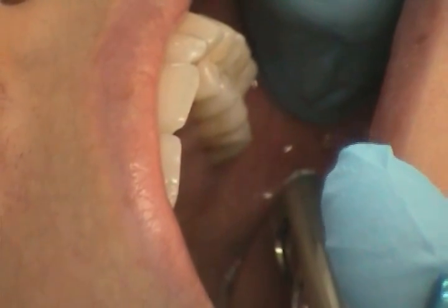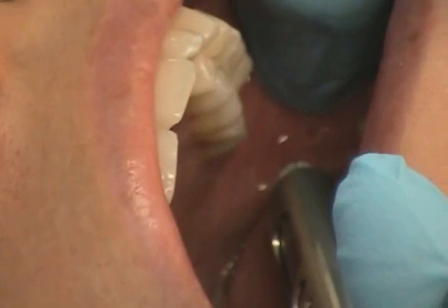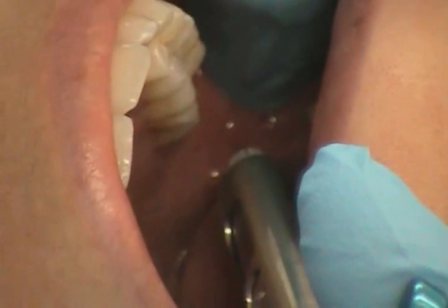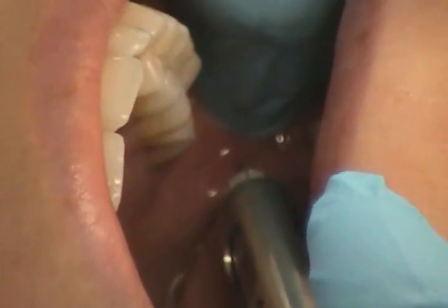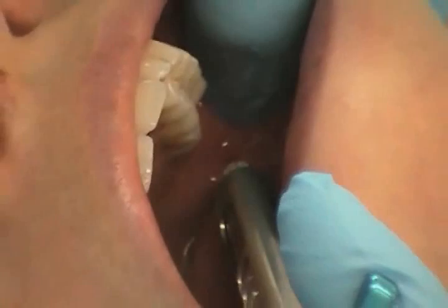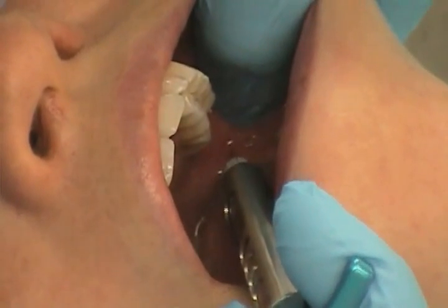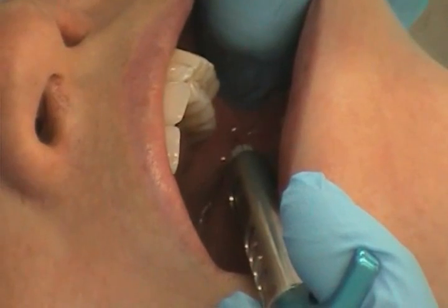In this injection, the bevel orientation is not critical. There is no pressure anesthesia. The depth of insertion is 20 to 25 millimeters, approximately two-thirds to three-fourths of the needle length. There is osseous contact. The aspiration potential is 15 percent — negative aspiration. The amount of solution is 1.5 milliliters over about 60 seconds.